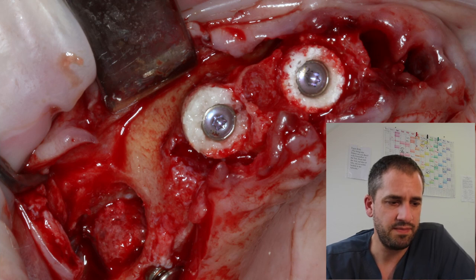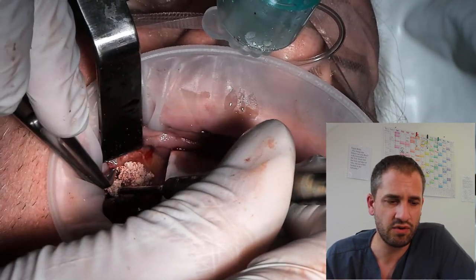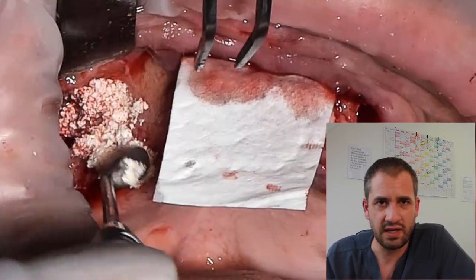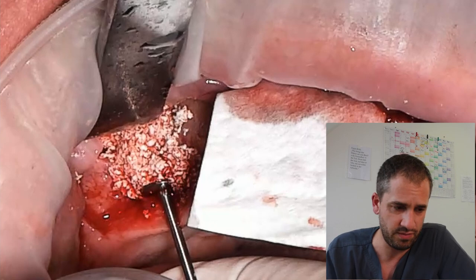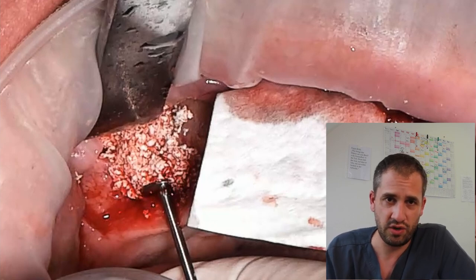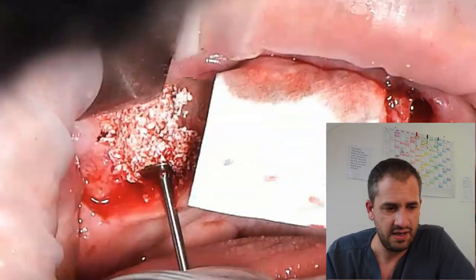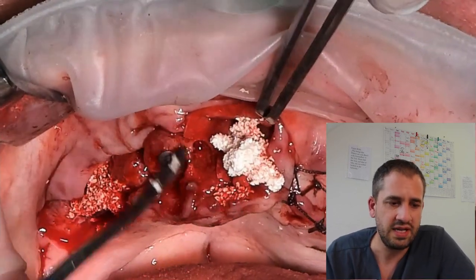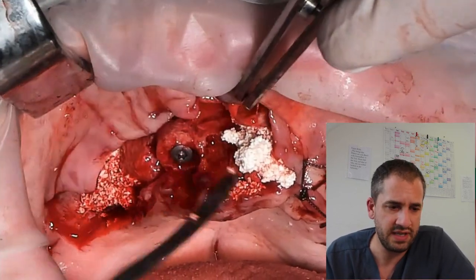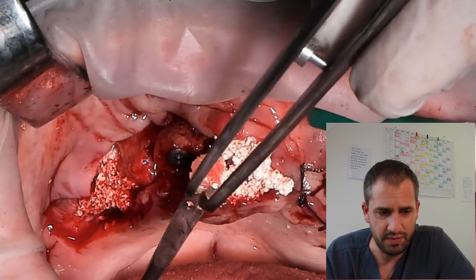You can see the bone ring in the sinus, you can see the fixation screw, and you see the two implants in the front surrounded by an allograft ring. Now I remove the fixation screw on the first implant and add some bone substitute material — it should be slowly or non-resorbable bone substitute. Then I put the membrane screw on top, which gives fixation of the bone substitute material. In the front of the maxilla I fill up the gaps with bone substitute material.